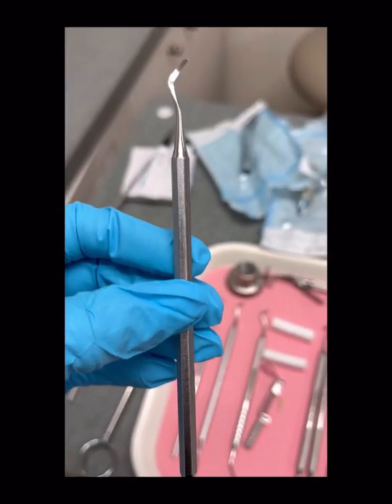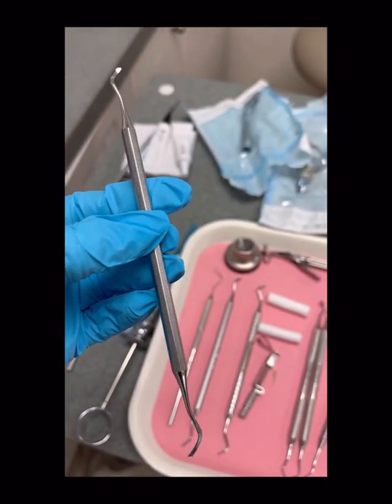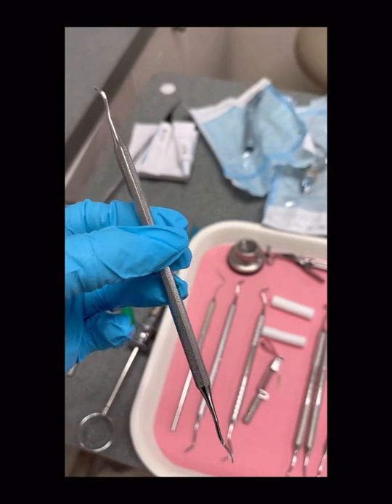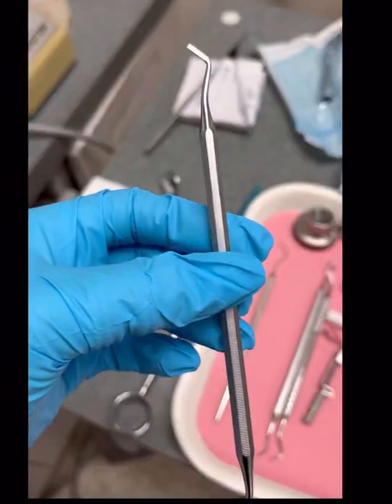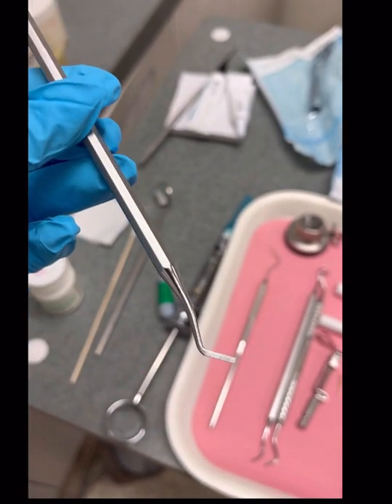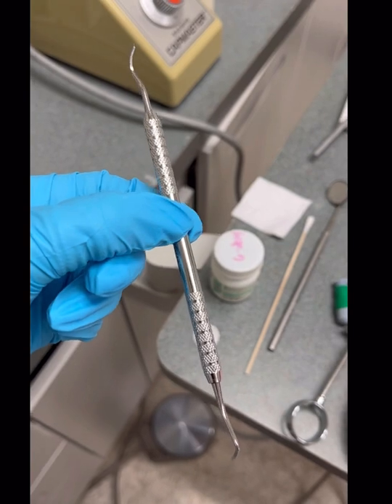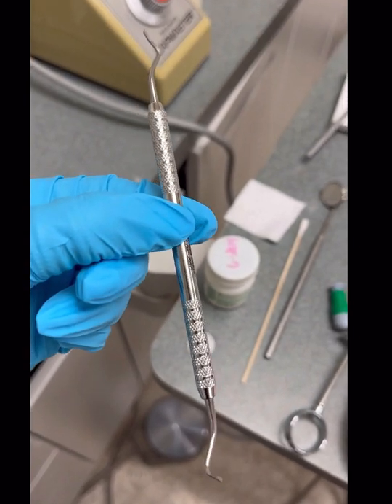The carving instruments that you must have on the tray are going to be the hatchet, the gingival margin trimmer, and mesial and distal. This is a gingival margin mesial. You will use a hatchet for planing and cleaving enamel walls during cavity preparation. And this is a gingival margin distal.